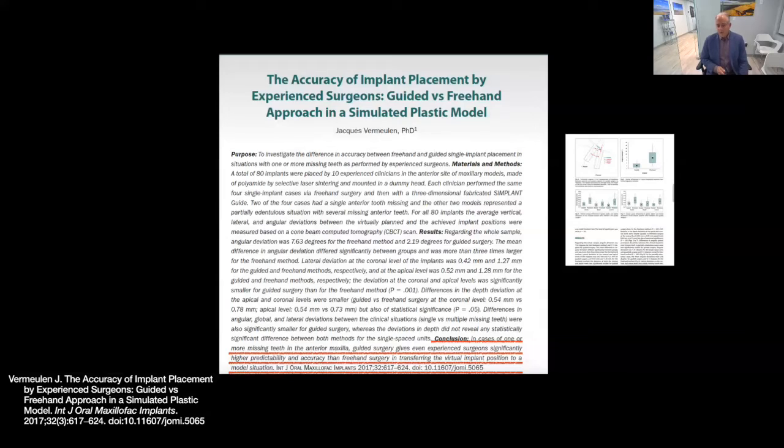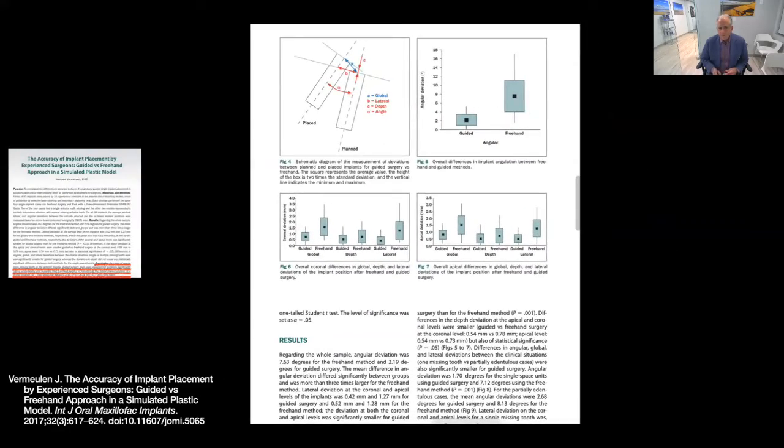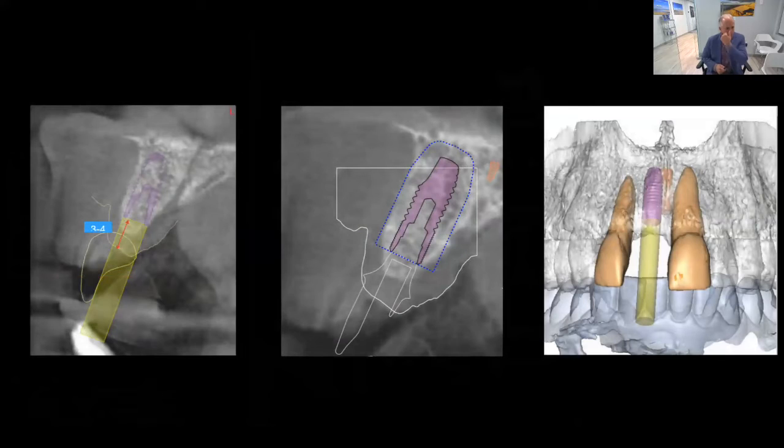And in the anterior maxilla, it's just critical because you can really refine where you're going to place your implant, right? So look at our planning from this perspective. We can determine that we're going to place our implant 3 to 4 millimeters subgingivally, right? So we can create enough running room, and we can even start to design our prosthetics.